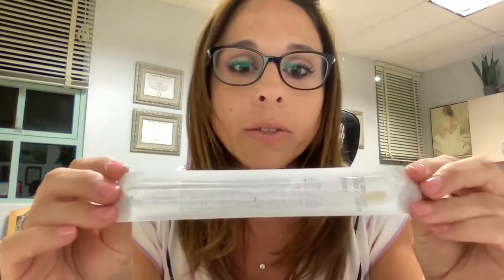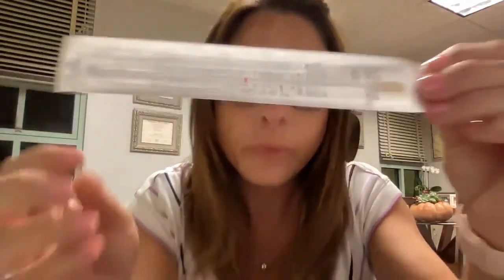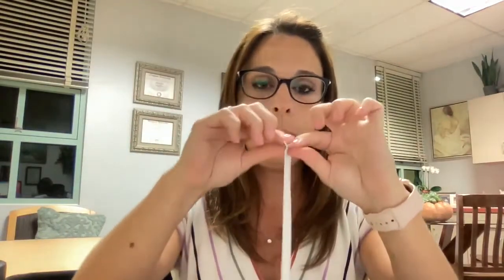On the swab, you'll see the little red mark right here. You're going to open the swab, peel it open. At the red mark, you're going to break it off. There we go. You're going to pull out the swab — the cotton fuzzy end like a Q-tip. That's the part that's going to go inside the nose.